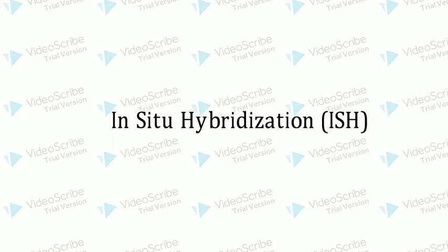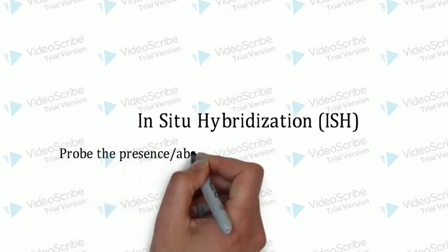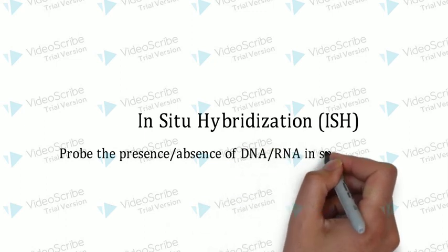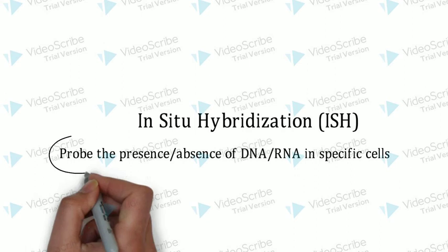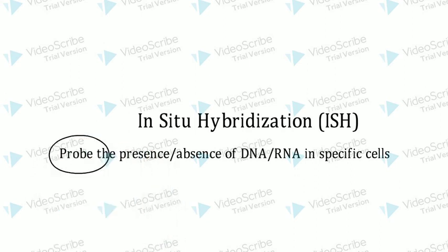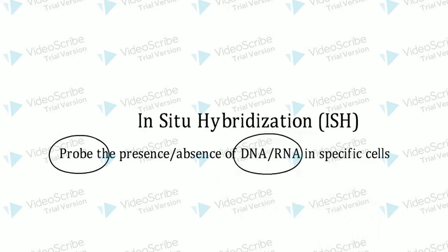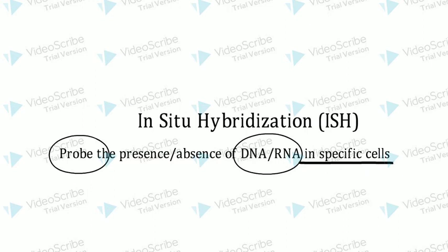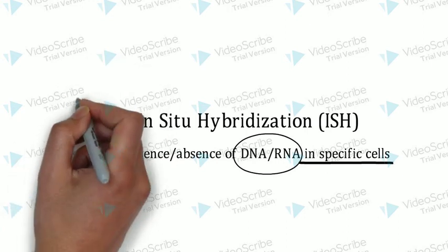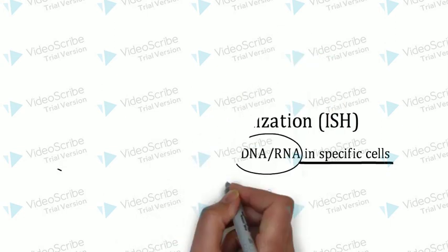We'll first look at the textbook definition of ISH. It's a method to probe the presence or absence of DNA or RNA in specific cells. The word to be emphasized is probe. So we are identifying molecules of DNA or RNA. We'll discuss how and why we need to do it, and why we need to do it in specific cells at all. To be able to understand this method, I will divide this video into 4 components.